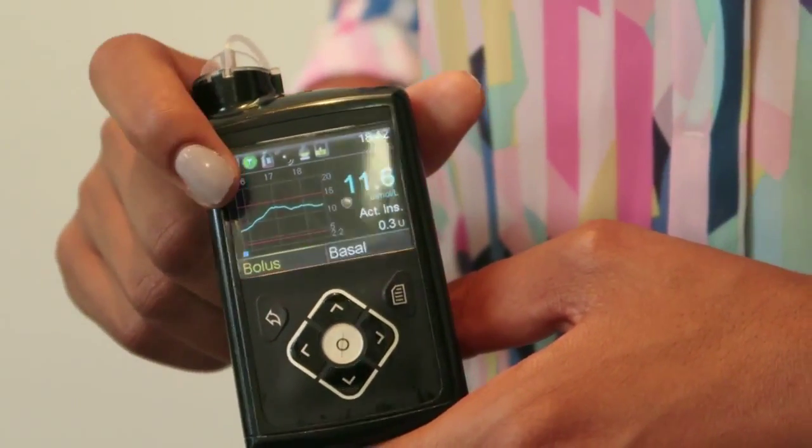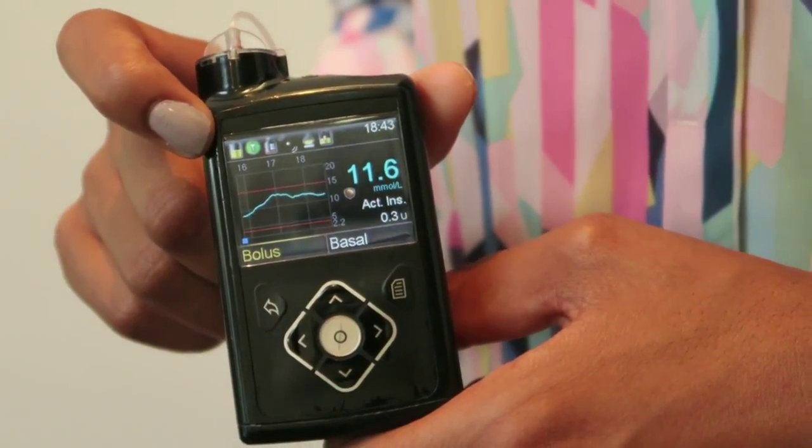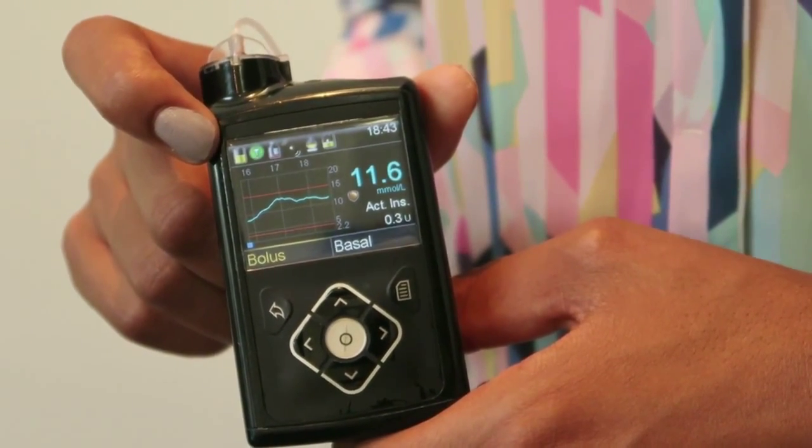Here we've got the bolus and the basal shortcuts that allow you to get to those options quickly. I found that they're the options that I use the most in the pump, so it's quite handy to be able to have those right on the home screen.